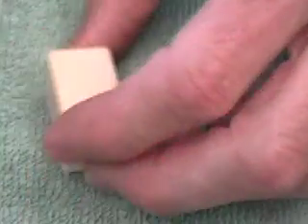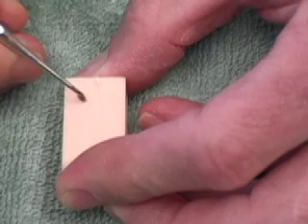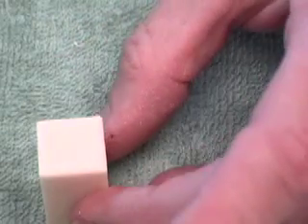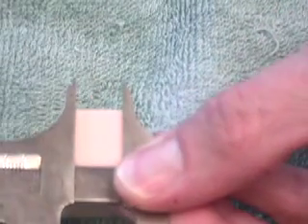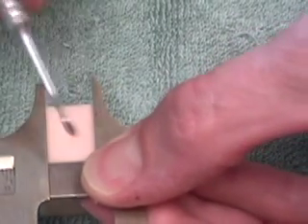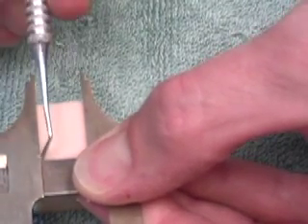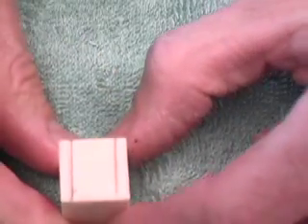I'm going to go ahead and mark our block so we know which side is the facial side. We'll put an F out here so we know which side to orient ourselves to. Our facial-lingual measurement is 11.8. I've set my micrometer at 12, and we'll mark our block right there at 12 millimeters. I'm trying to position the tooth more or less in the center of the block. There are our two marks on our facial-lingual measurement.